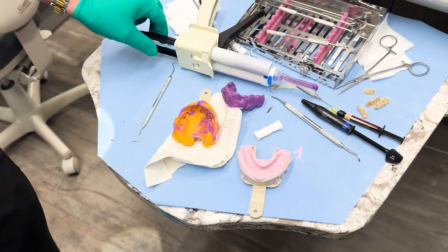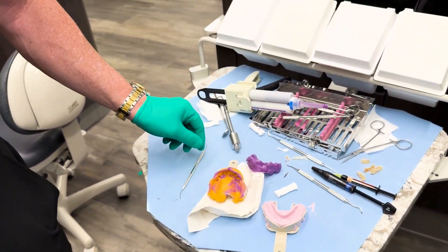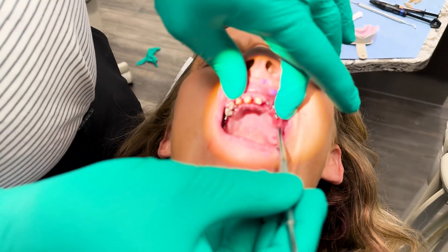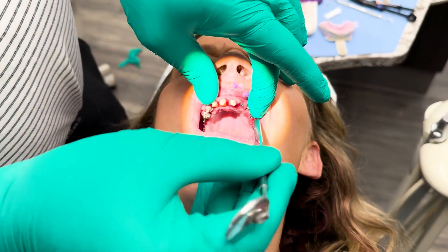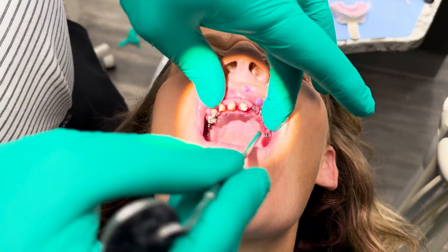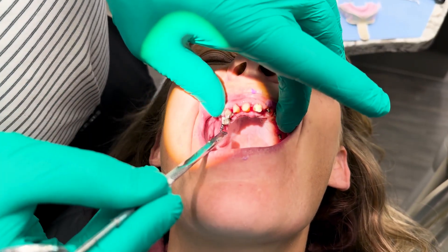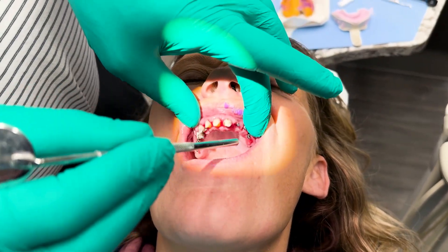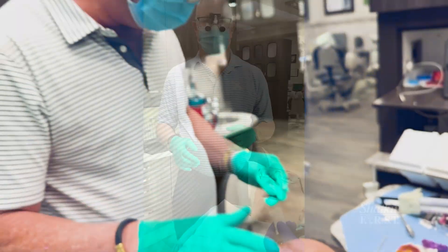So now we can go ahead and put her temporary on the top. You can take a look at her mouth here — here's the implants and then the natural teeth in the front. Okay, all right, take a break.